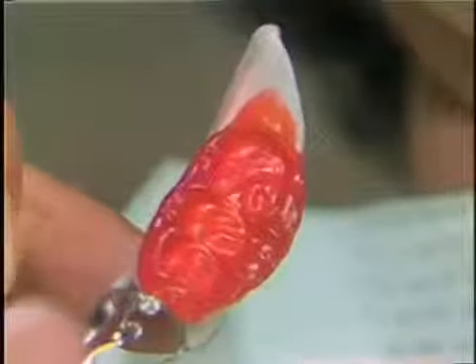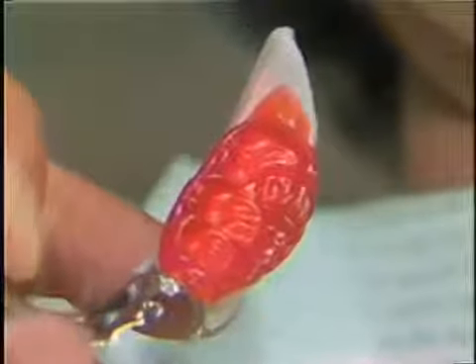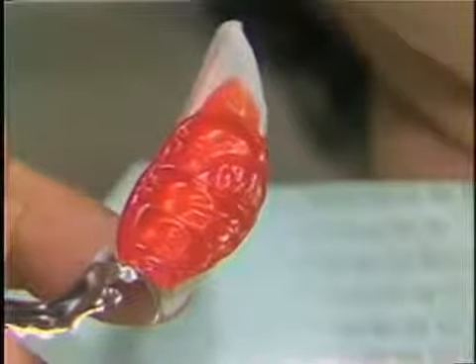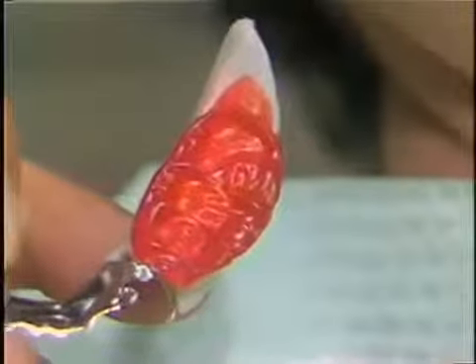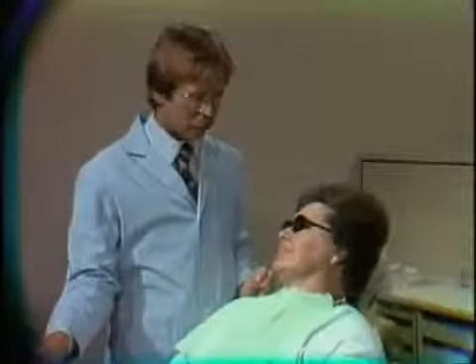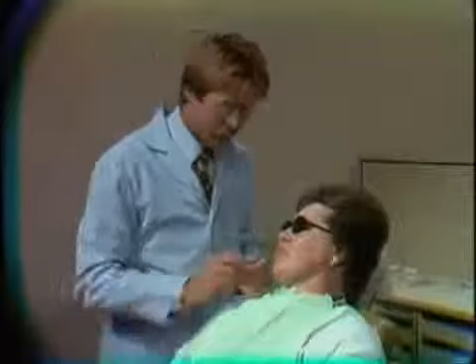Now our job is to record the eccentric positions, both border positions, lateral and protrusive, and then infraborder positions. So we're going to place it back in the mouth.